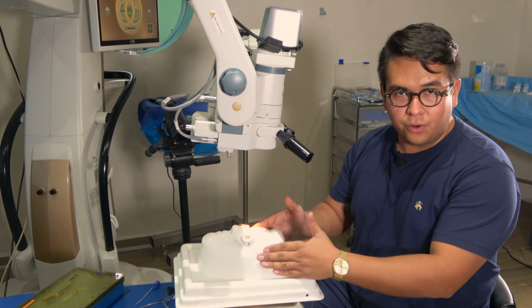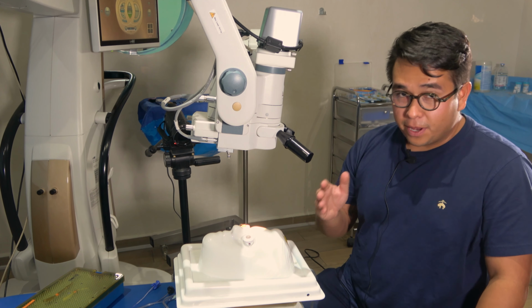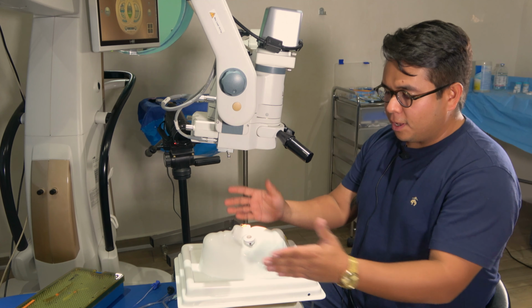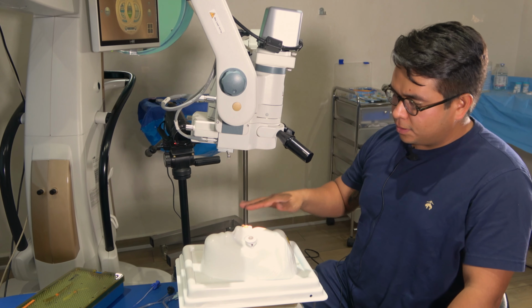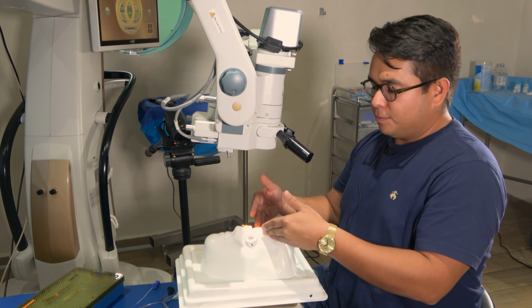That is something really important, and in our first surgery it could be our best friend or a nightmare. We're going to talk about a normal vitrectomy, a normal retina surgery. This is the idea of the patient position. The patient needs to be parallel to the floor so we can have a comfortable position.